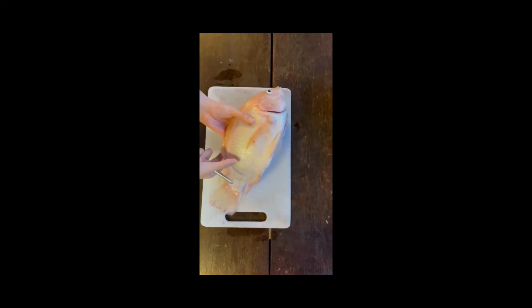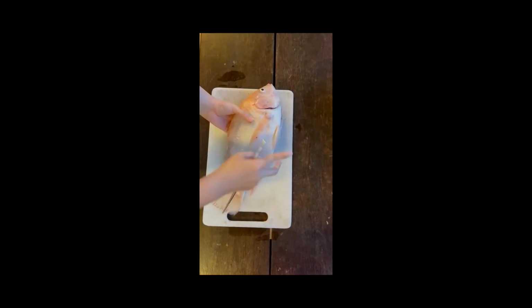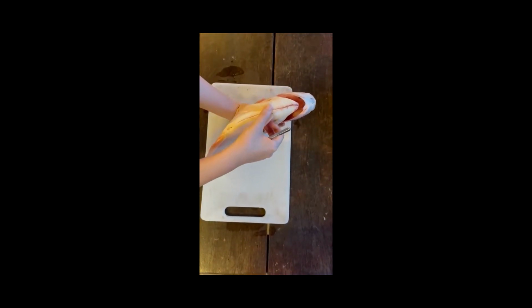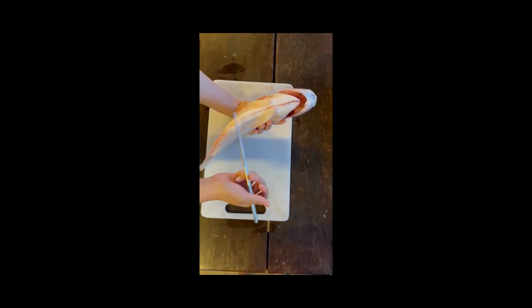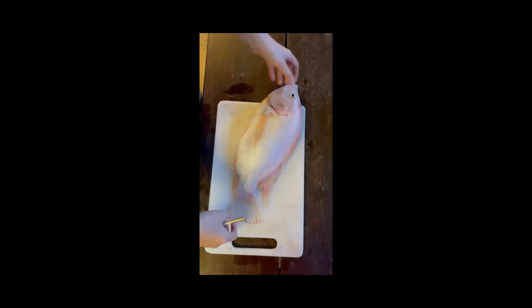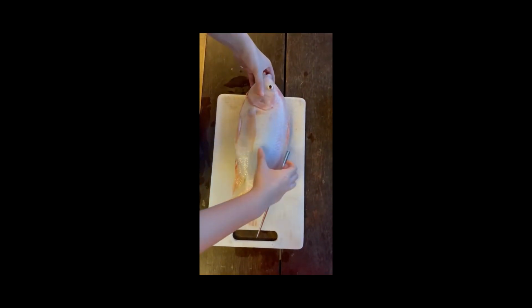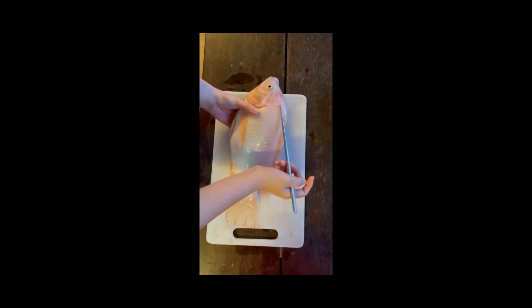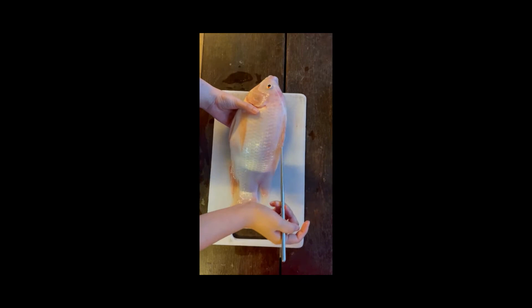Ovaprim is used as a spawning aid to induce ovulation and spermiation properly in conditioned brood carp. Where do we inject it? There are 2 common places to inject hormones in the fish. Firstly, an intraperitoneal injection is given through the ventral part of the fish behind either the pelvic or the pectoral fin. The second one is intramuscular injection. These injections are commonly done on the dorsal part of a fish above the lateral line and below the anterior part of the dorsal fin.